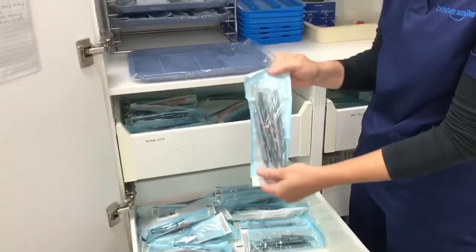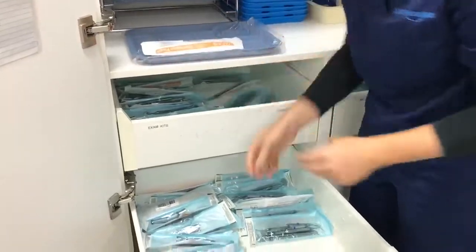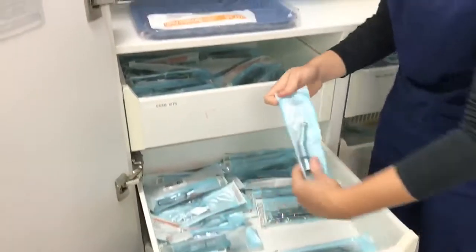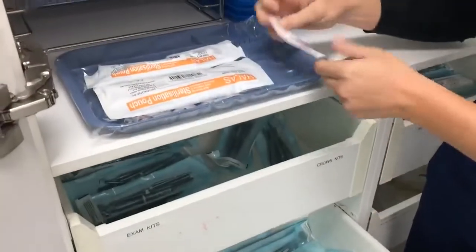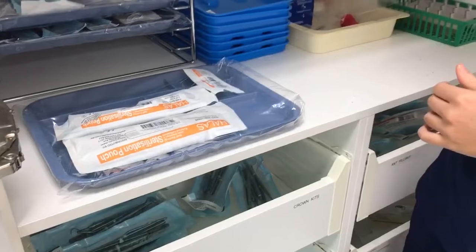You will need one hygiene pack, one prophy handpiece, one ultrasonic tip, and a square piece of gauze.